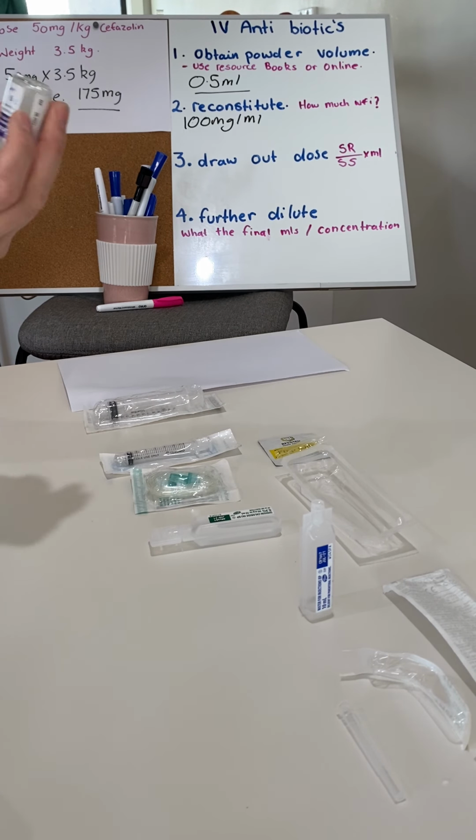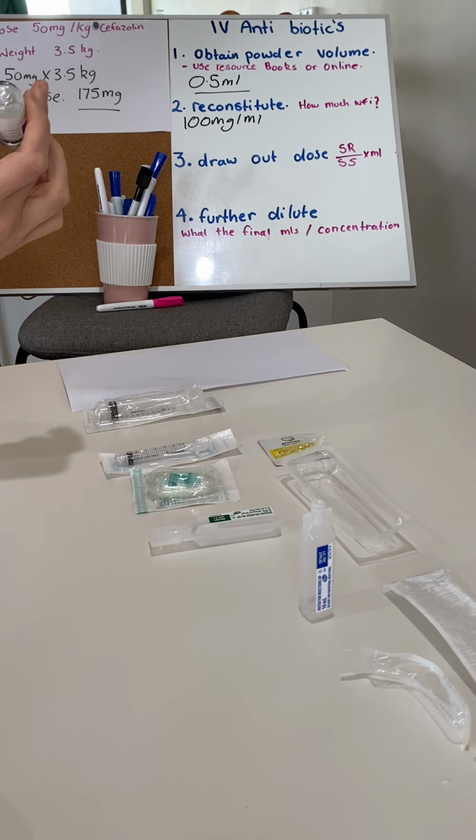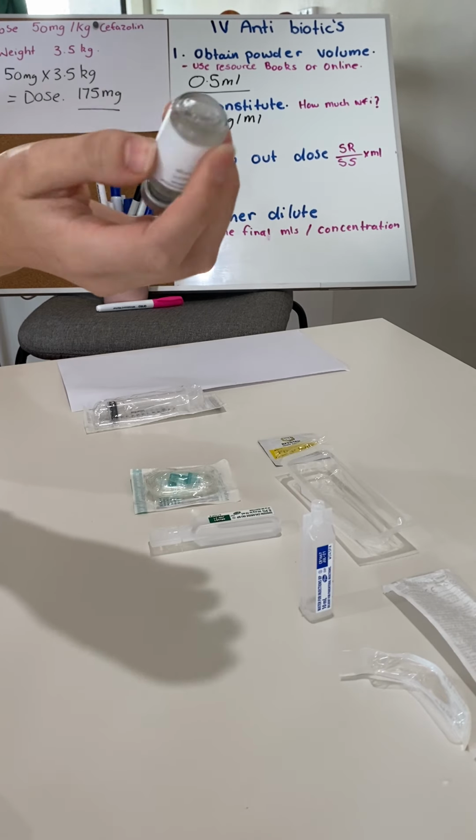You give it a nice good shake to make sure that we disperse the medication properly. As you can see, some of them take a little while and there'll be little specks floating about.